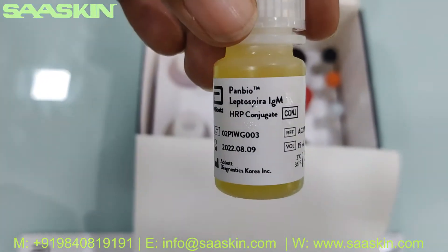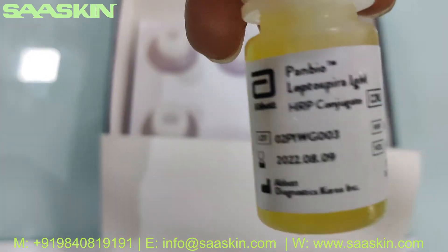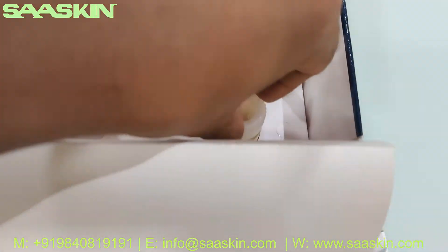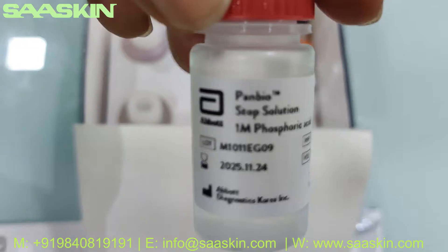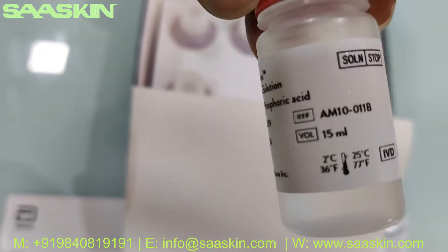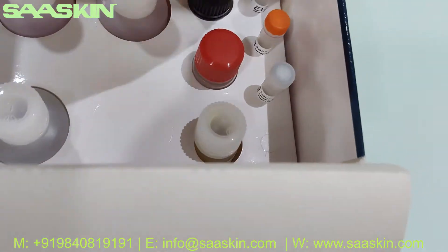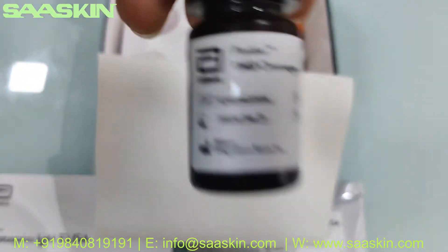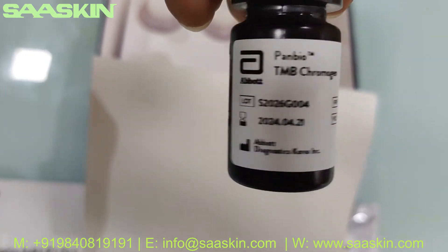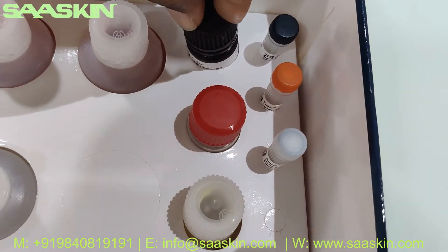This is the HRP conjugate buffer solution — one 15 ml bottle. And here is the stop solution buffer, again a 15 ml bottle. And what else — a TMB chromogen, again a 15 ml bottle buffer solution.